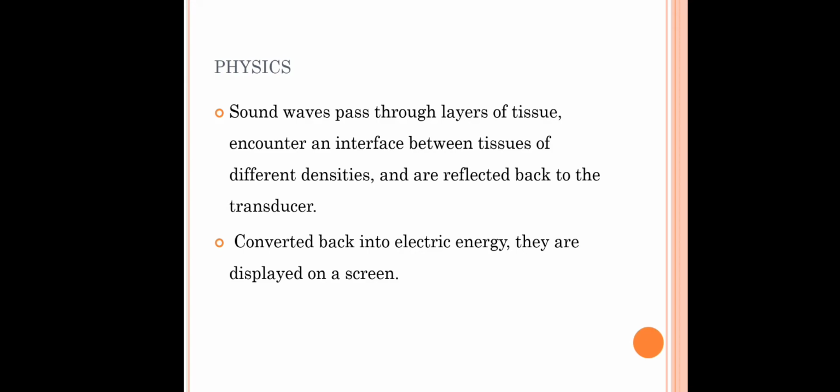Then this sound wave passes through layers of tissue and encounters an interface between tissues of different density, and again reflects back to the transducer. In the transducer it is converted back into electrical energy that is then displayed on the screen in the form of the image.